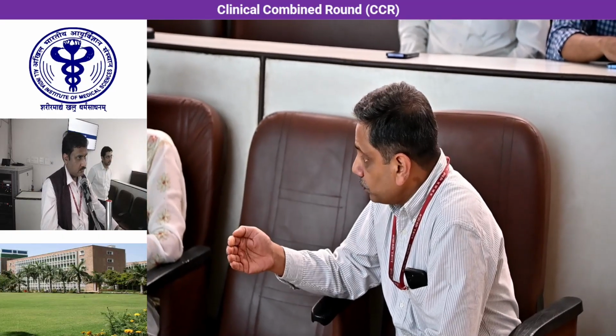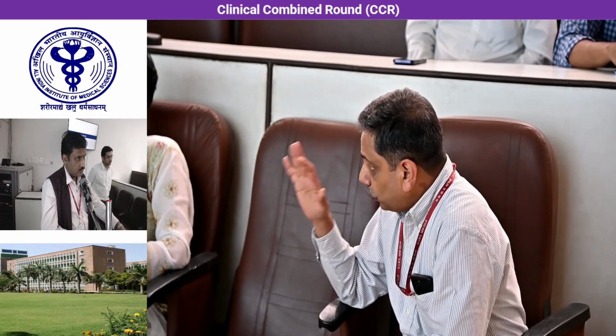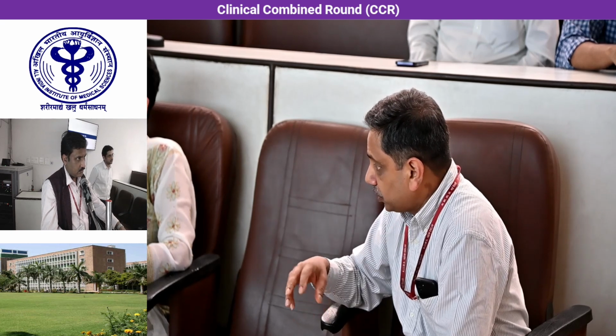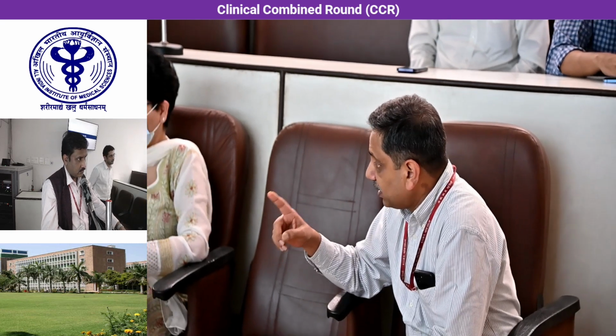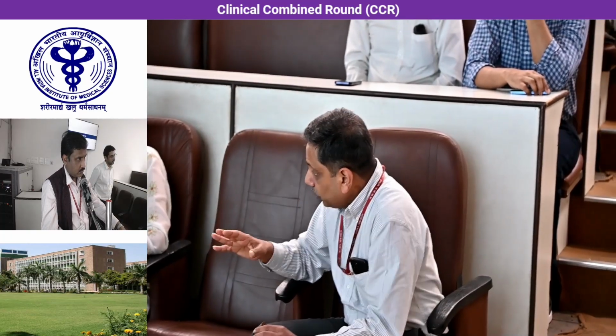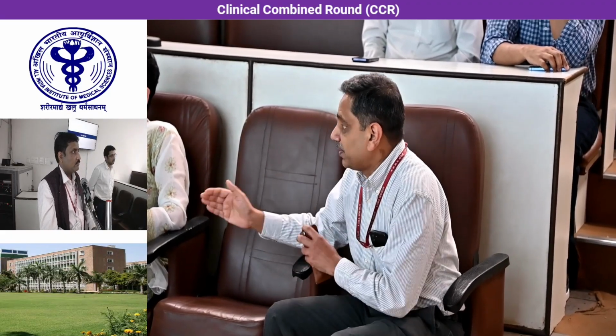It has shown better outcomes when surgeons with lower competence and lower volumes perform laparoscopy versus robotic. So a surgeon with low volumes doing laparoscopic partial versus robotic partial, his robotic partial outcomes are better. A surgeon with high volumes who does laparoscopy regularly has no worse outcomes than robotic. So it's got a lot to do with volumes and many things.